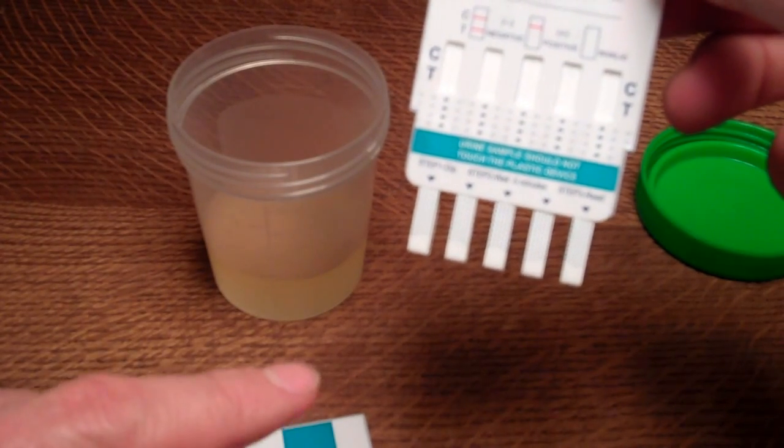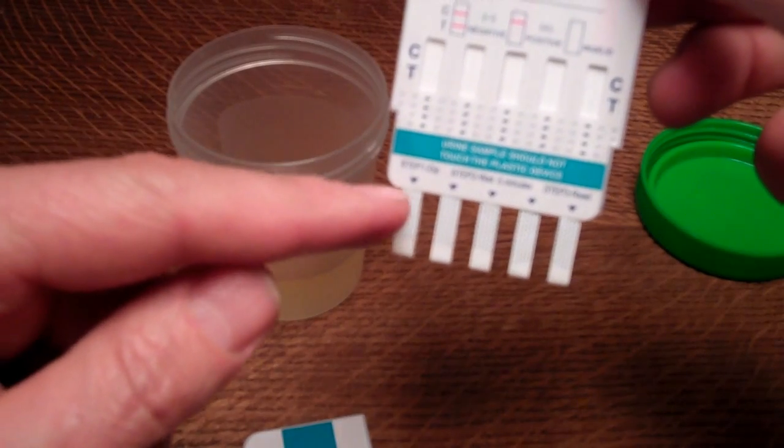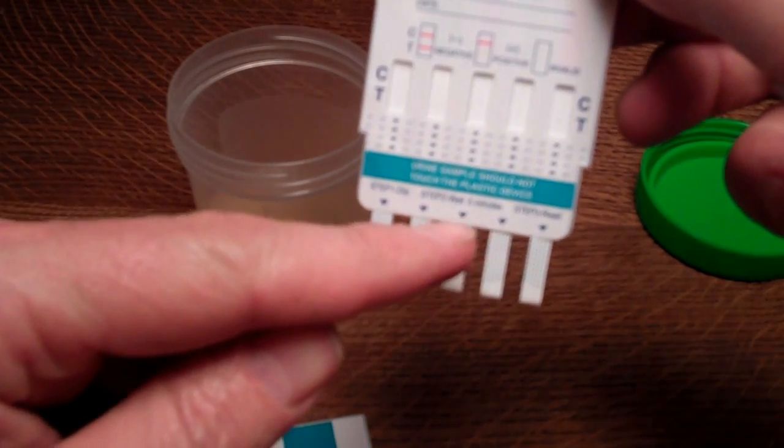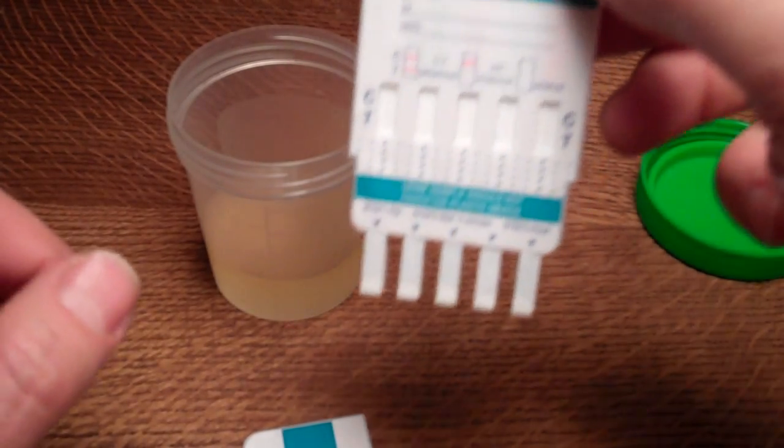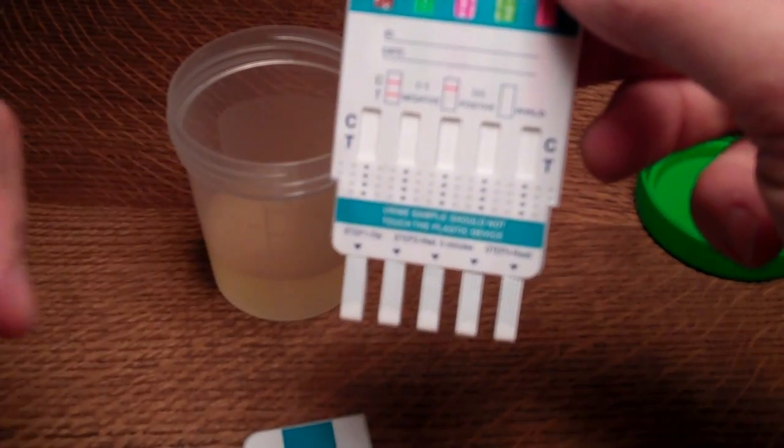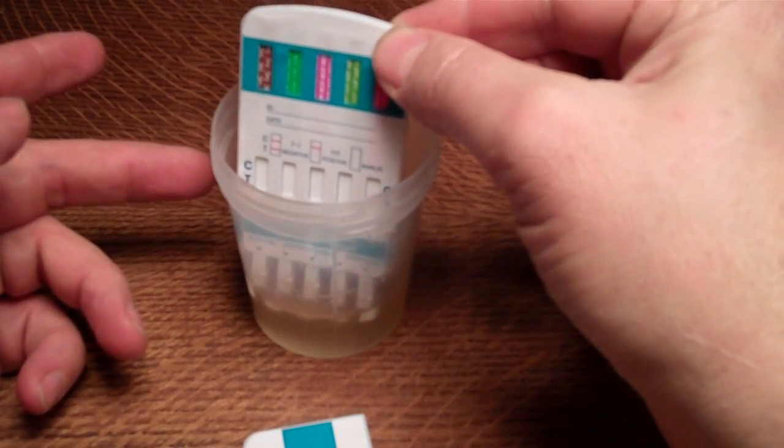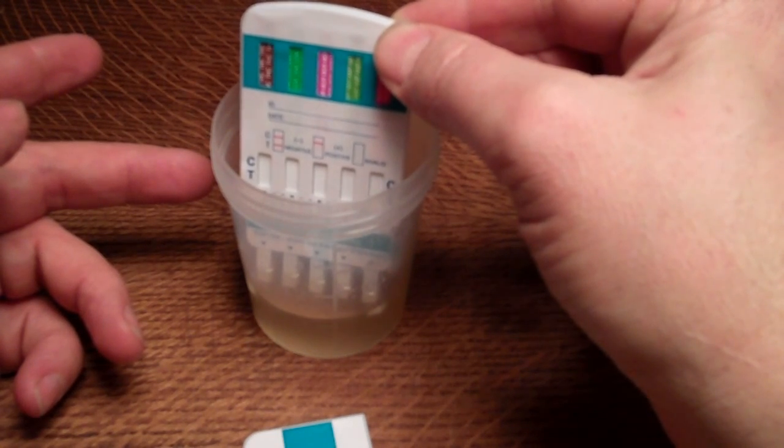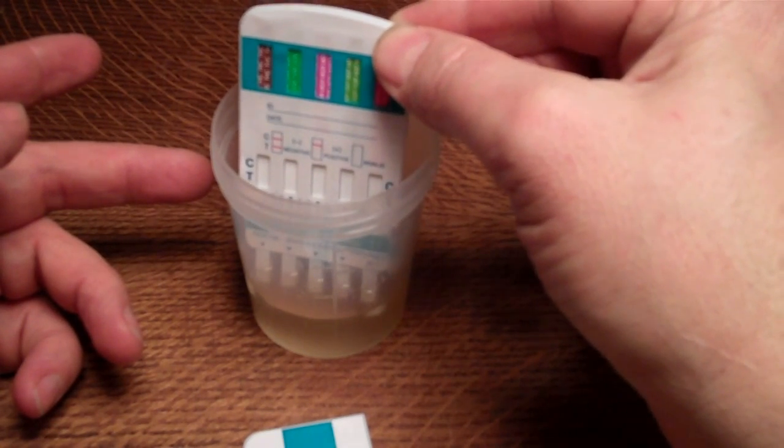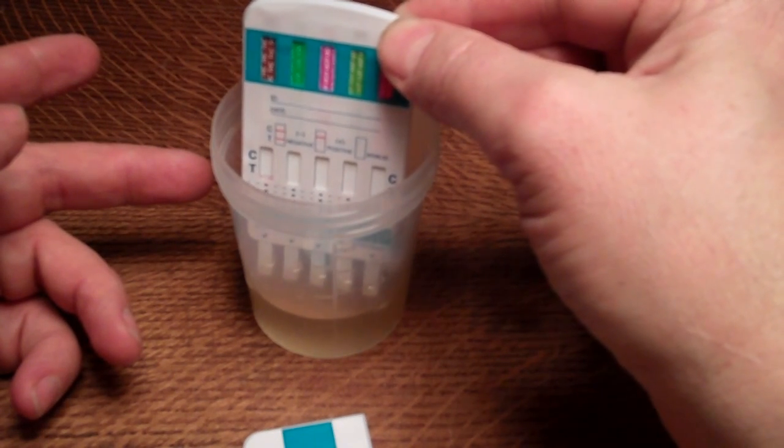The urine sample universally should not touch the test device, so the maximum dip line is indicated on this test membrane panel as that triangular indicator. You don't want to get any splash or urine contaminating the panel. You just want to dip the prongs into the urine sample about three-quarters of their height, and you're dipping it in for between five and ten seconds.